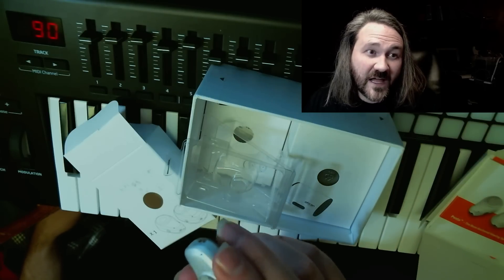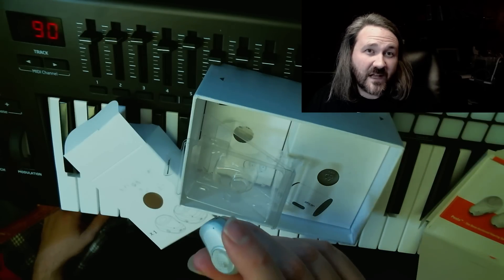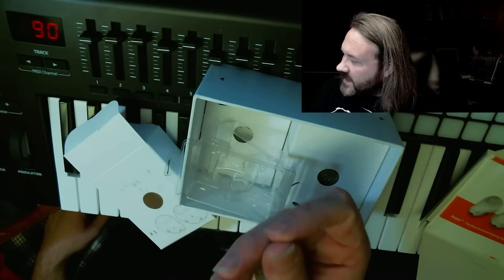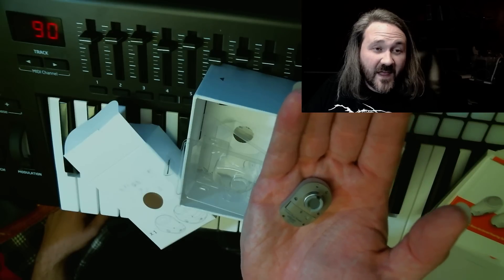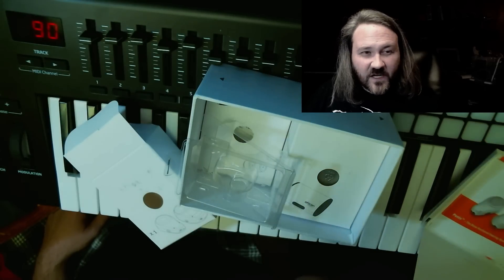For most people, hearing aids are about speech. I'm a musician, so it's not just about speech for me — it's about fidelity, being able to hear what I'm actually doing as a musician, and that's pretty important. But there it is — that is the super expensive processor that goes on that little implant. Very small, very inconspicuous. And I think they're coming out with a new one next year. It's made by Oticon Medical.